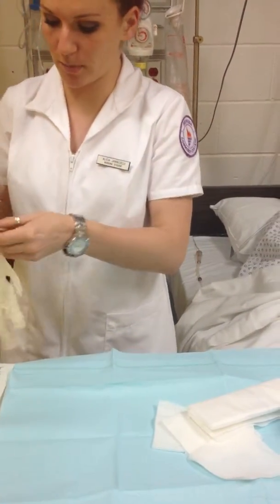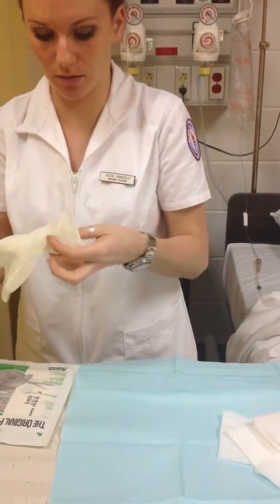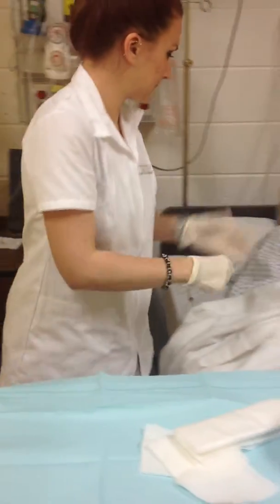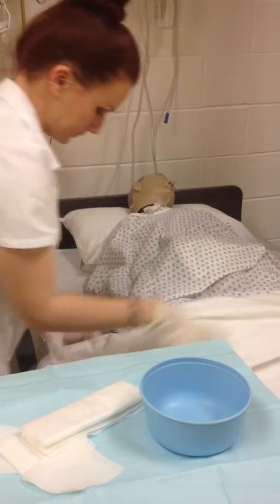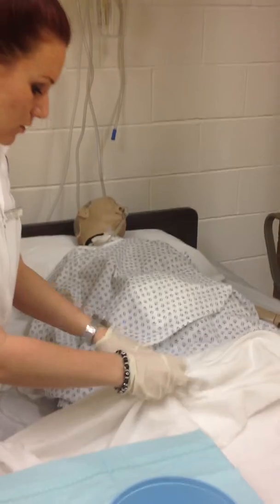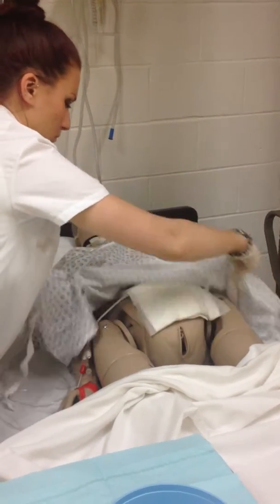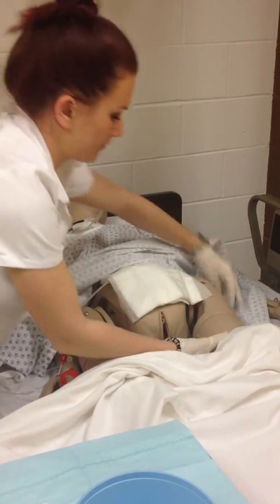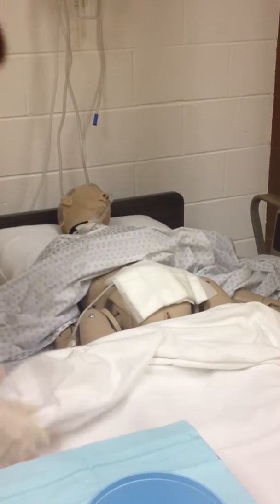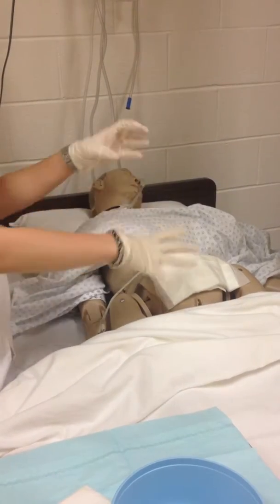Now I'm going to put on clean gloves, and we're going to check our patient's incision. We're going to be sure that we provide privacy for the patient while we do this. I'm going to take this off layer by layer, just in case there's anything underneath.